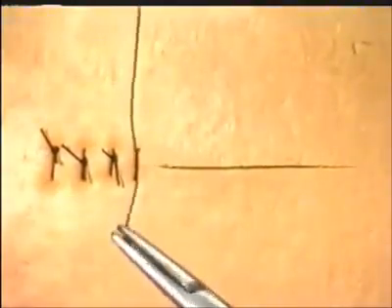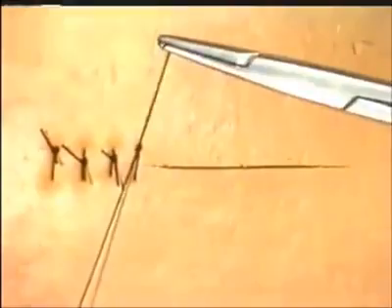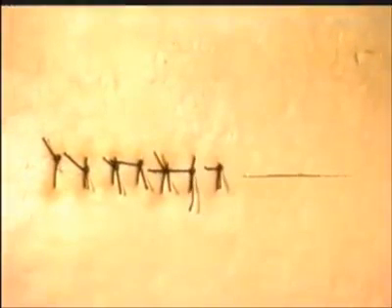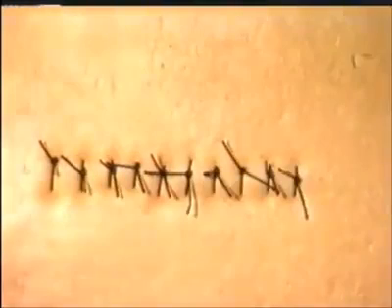Once again, tie your knot, making sure that it lies correctly without any tension. Once the wound is closed, ensure that none of the knots lie over the suture line.